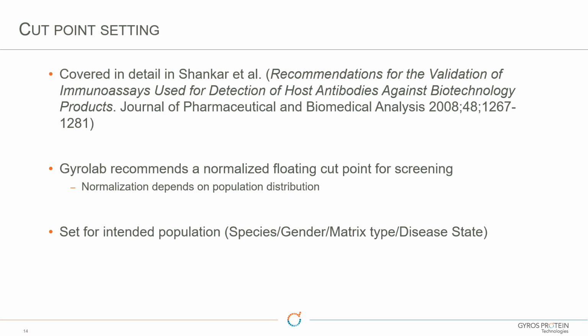Interesting. And I know that different disease populations is really critical, because when you have an inflammatory disease like rheumatoid arthritis, the patients are spitting out huge amounts of IgGs all the time, and so it can really create a high backdrop. Yeah, and the other thing I've seen as well is that in the disease population, the target concentration is much higher than you've seen during your validation, so that can impact as well.